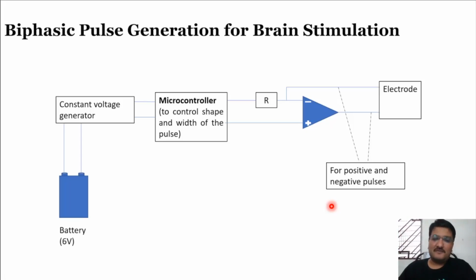So there are a lot of applications of brain stimulation, but the idea of this particular module is to glance through the topics of multi micro electrode arrays or microneedles, as well as, with a slight additional modality in the microelectrode array, easily getting a response to a particular stimulus. I hope these two topics, microelectrode arrays and brain stimulation, are clear to all of you. You can feel free to explore more about the topics to get a better idea.